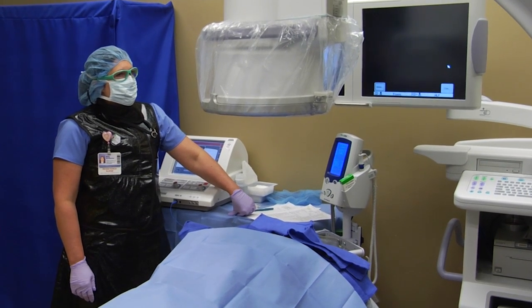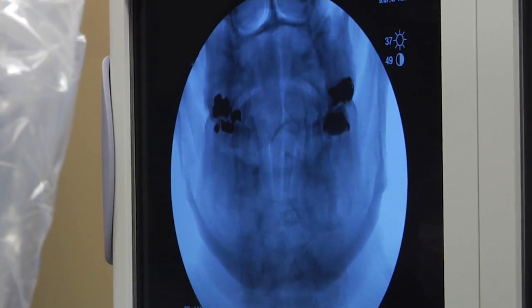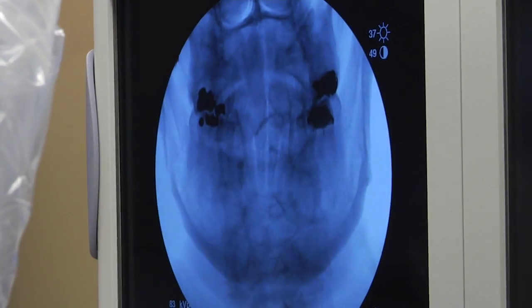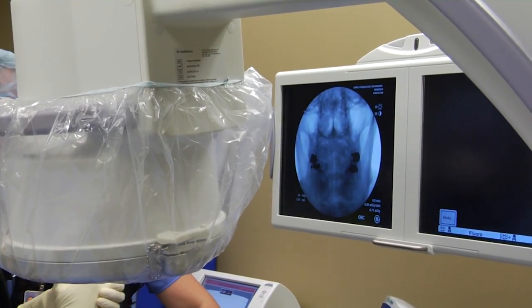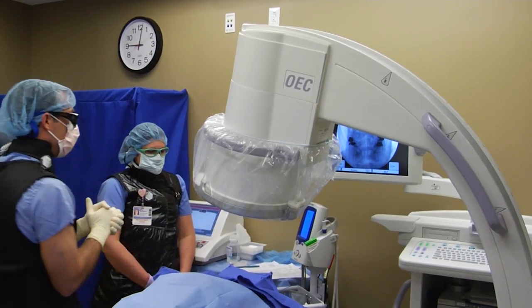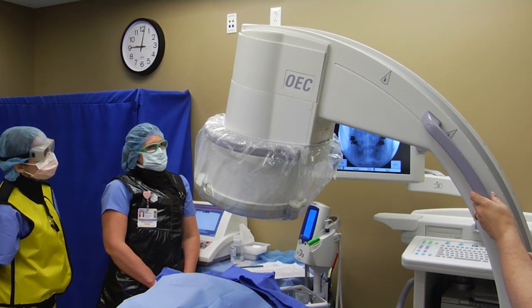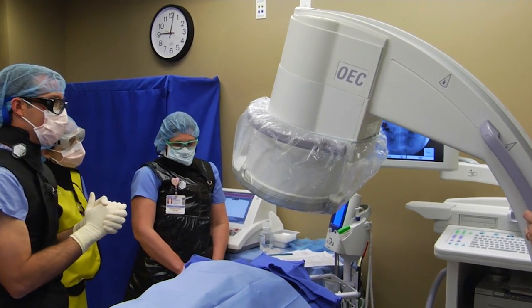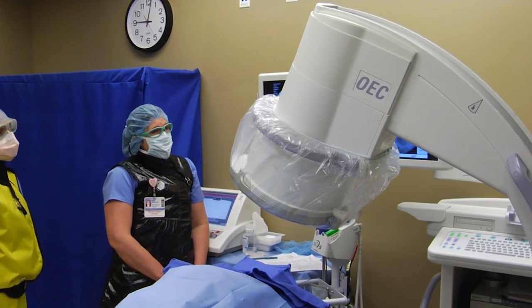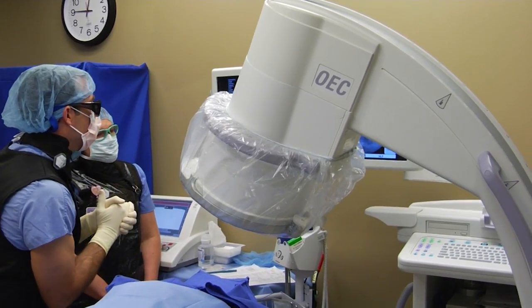The fluoroscope is first positioned in an anterior-posterior view. This allows us to identify the lateral mass of C2 and C3. This can sometimes be difficult to visualize, so we can use the lateral mass of C1 and C2 as a starting position. Once we have identified the facet joint line between the lateral mass of C2 and C3, we angle the fluoroscope to obtain our trajectory view. The image intensifier is tilted caudally to identify the waist of the lateral mass of C2 and C3, followed by approximately 30 degrees of ipsilateral oblique.